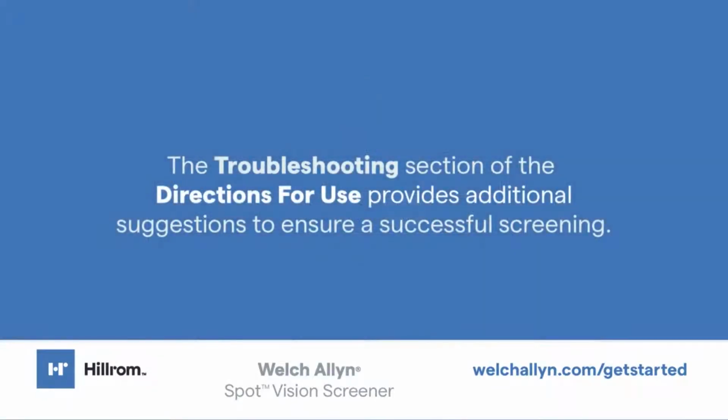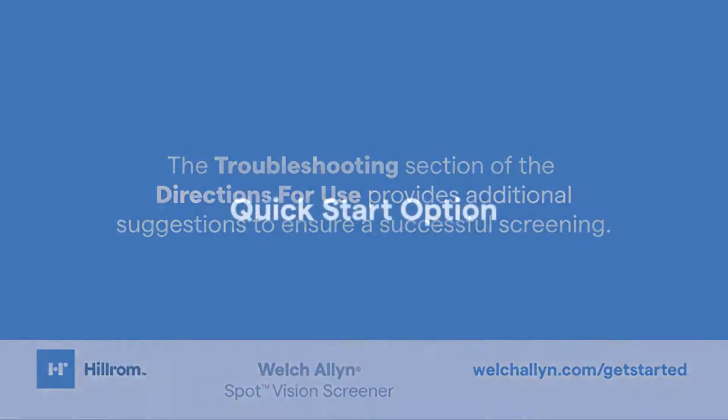The troubleshooting section of the directions for use provides additional suggestions to ensure a successful screening.